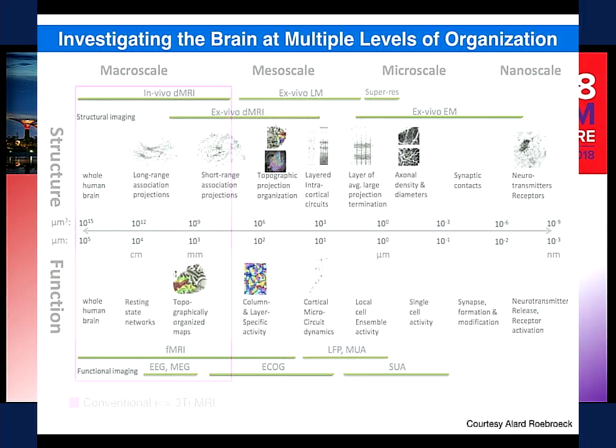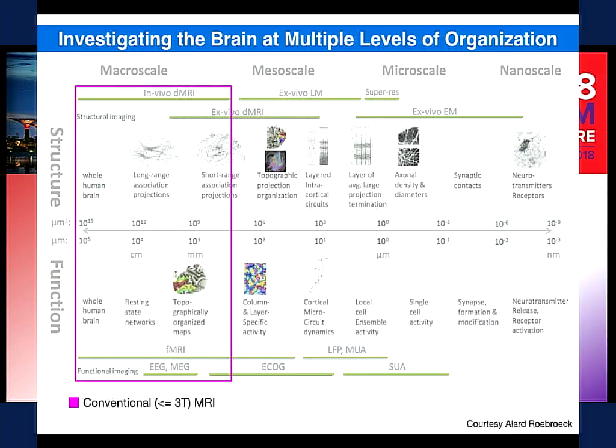Now I come to the second part of my talk. And what I said now was mainly, except the last experiment, related to conventional resolution imaging. On 3 Tesla, people use typically something like 2 millimeter, a bit more, a bit less. That's the resolution used there. But 2 millimeter is not high enough to resolve cortical layers functionally and cortical columns.